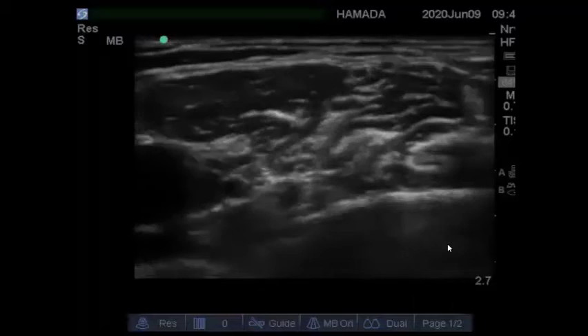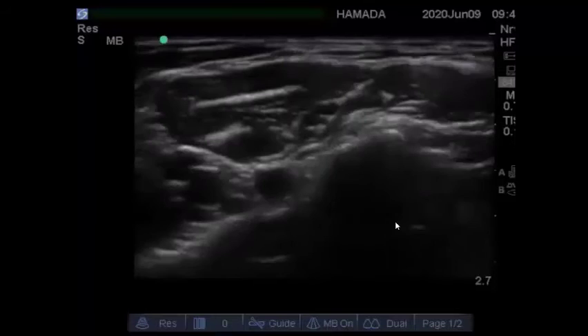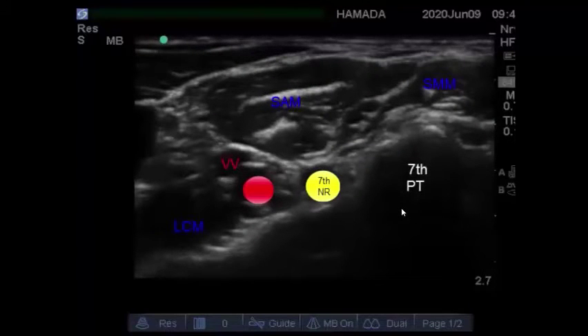The first level is the seventh cervical level. Here we can see the seventh posterior tubercle and there is no anterior tubercle at this level. This is the seventh nerve root, and this is the vertebral artery and vertebral vein. We can also see four muscles: longus colli muscle, scalenus anterior muscle, scalenus medius muscle, and lastly the sternocleidomastoid muscle.